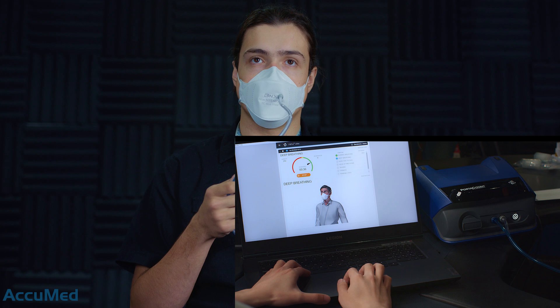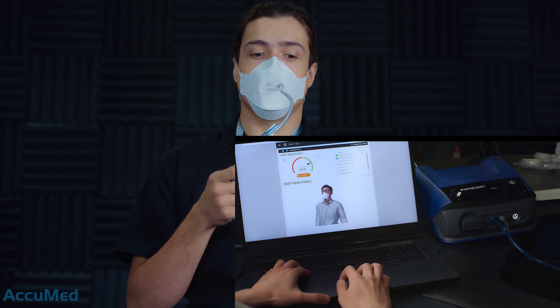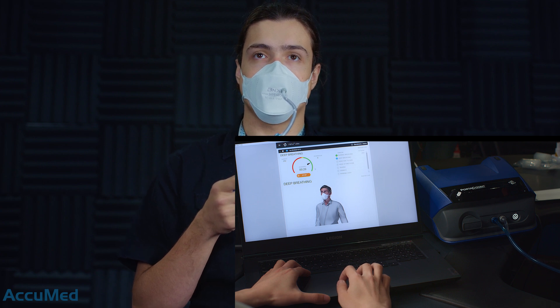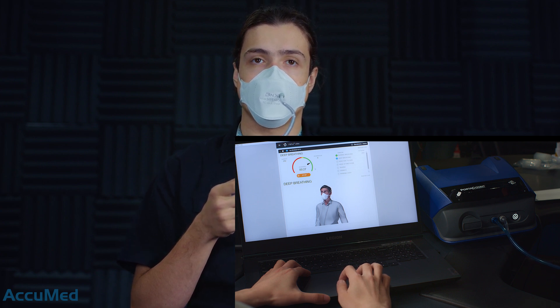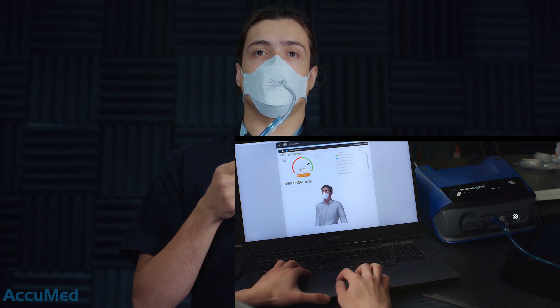As we can see right now, again the indicator is in the green section and the fit factor at the end is going to be more than a hundred, most probably. It could be more than two hundred actually.